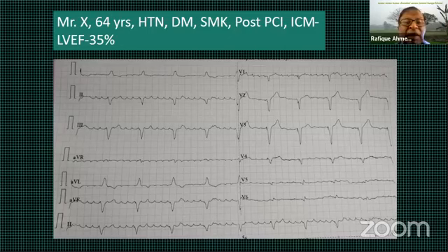So the question is, is it atrial flutter or atrial tachycardia? Mechanistically, if you look at lead V1, it looks like a discrete P wave. In flutter, you don't see the, but actually in V1, even in typical flutter, you can see a discrete P wave. So the distinction between atrial tachycardia and atrial flutter basically becomes the rate cutoff. And I think there is significant overlap in this diagnosis. So if it is this one, I'll call atrial flutter. If the same thing was at a rate of 130, I'll probably call it atrial tachycardia.